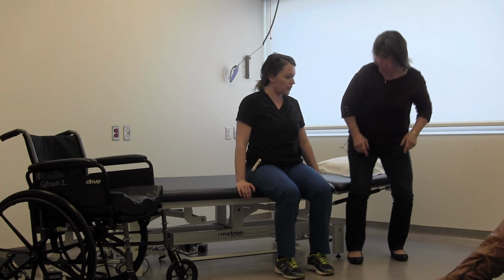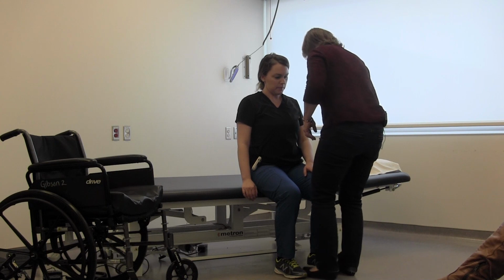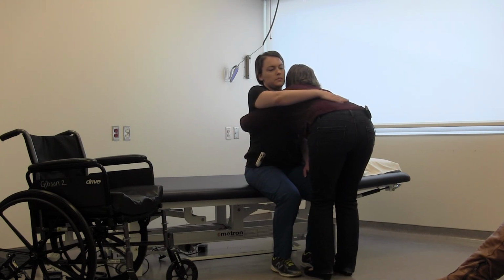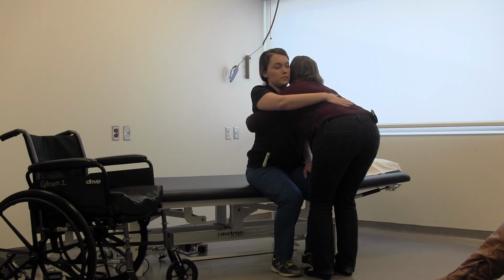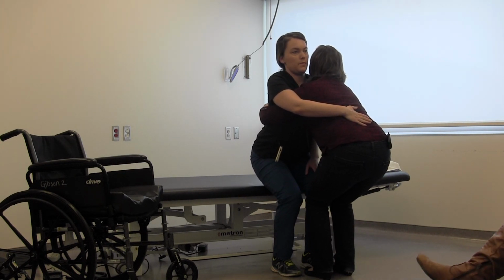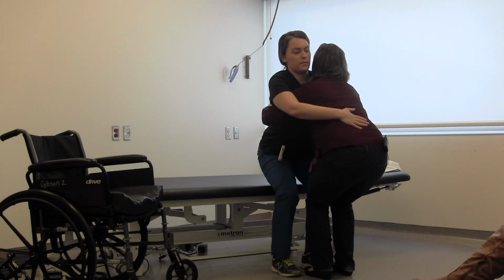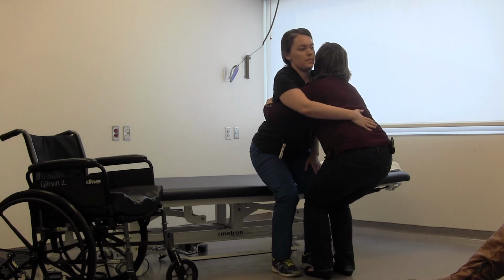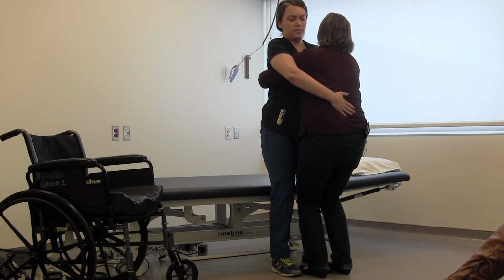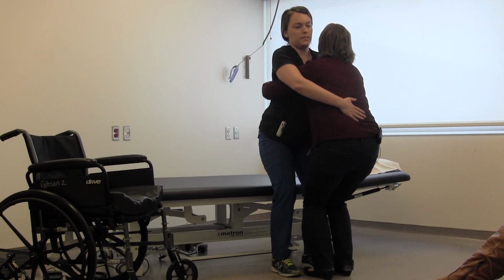Should I do one more time? So one more time. Can you bring your feet back a little bit? There we go. Put your arm around me. Sit up tall, look straight ahead, and I'm going to rock myself just once. And then I can move her in any direction I want, or I can even get her standing up, like that. Okay? So let's sit down.